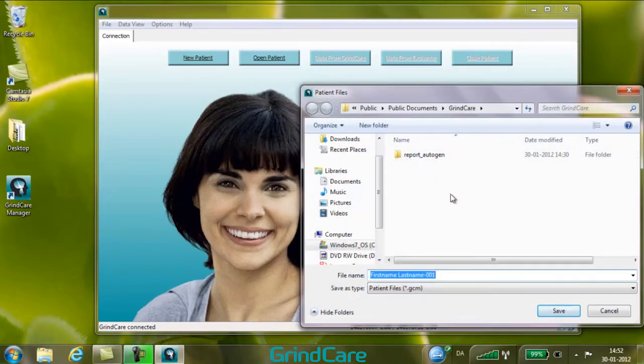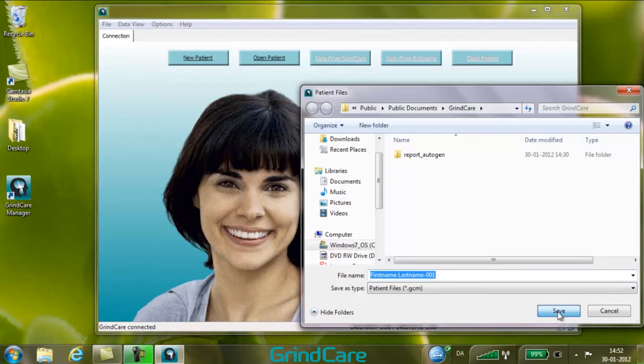Click Save to save the file with the name and location suggested by GrindCare Manager. If the name is changed, please note that the name needs to contain a hyphen to be a valid GrindCare Manager file name.